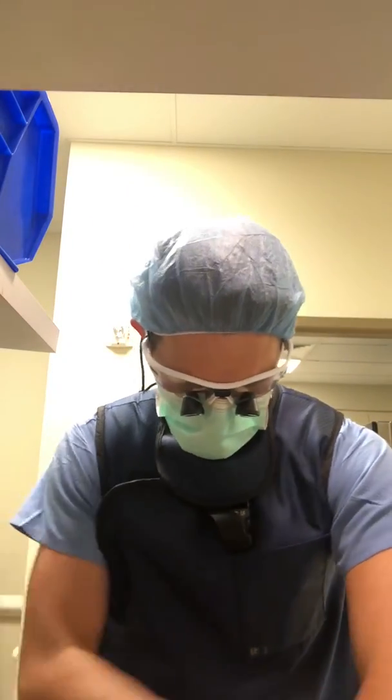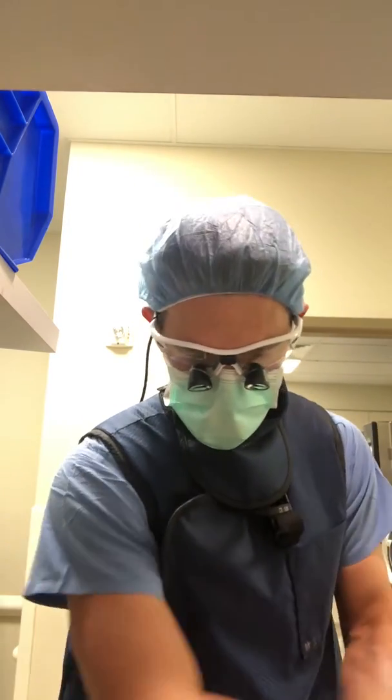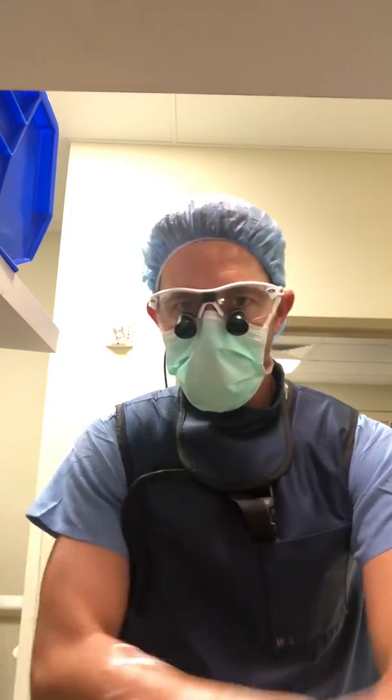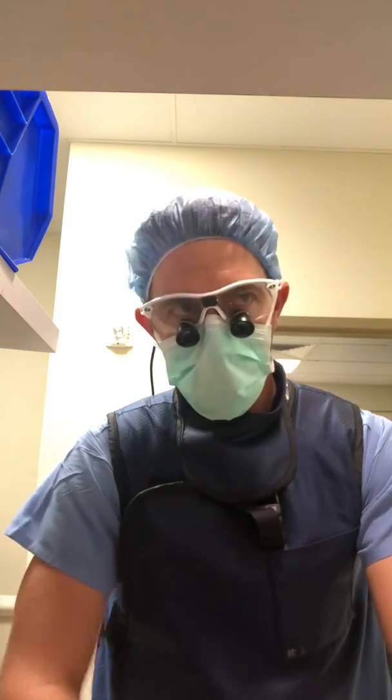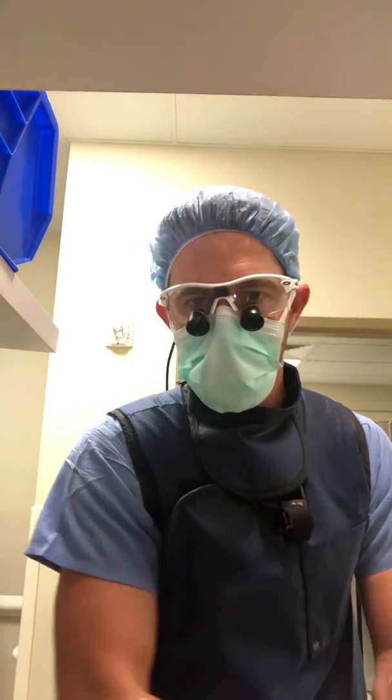So I'm getting ready to go back and do this surgery. This is, again, a cervical disc replacement at C6-7 — a pretty common level. The patient has been struggling with pain in her arm, primarily on the right side, for greater than six months now, starting after a car accident. That's a fairly reasonable timeframe for a traumatic disc herniation.